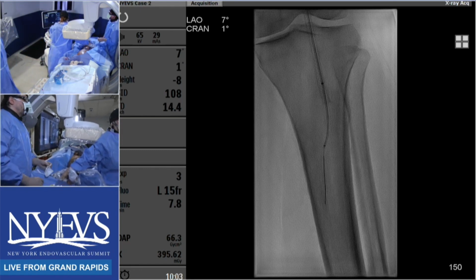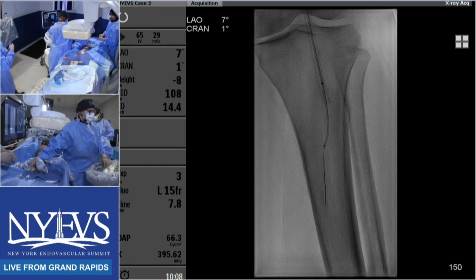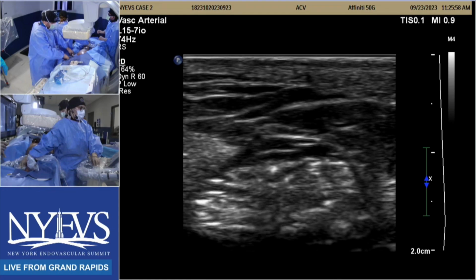Can you guys put the EVUS images up, please? So I guess I can speak to the surgical. And I'm sorry, Serini, why are you getting the pulse of the panel?